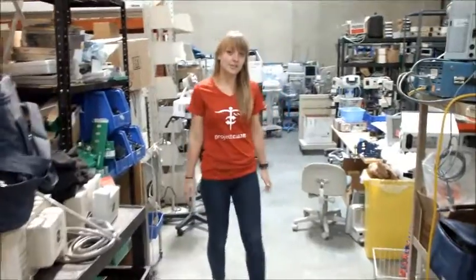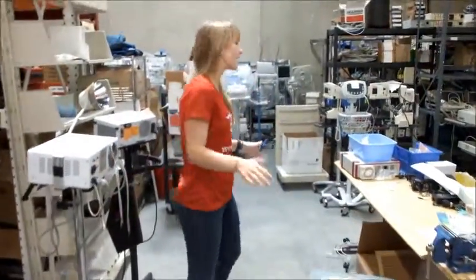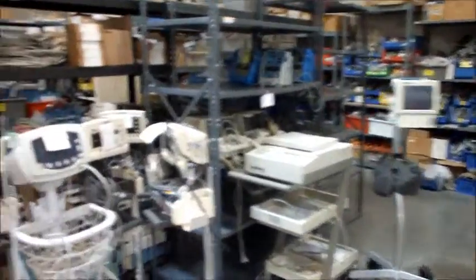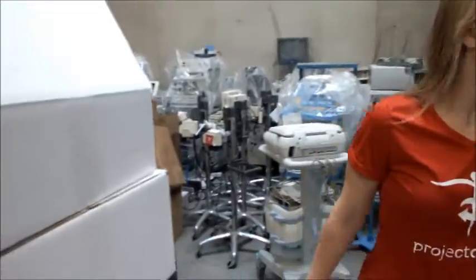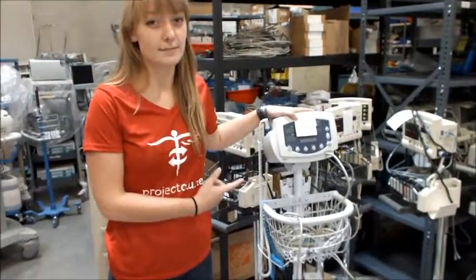The biomed area of the Project Cure warehouse is pretty big and EKG machines can be found anywhere in the warehouse. Sometimes they're standing on stands or on the shelf, and oftentimes you can find them back behind the shelving. Make sure that if the EKG machine already has a sticky note on it, it's probably already been tested.